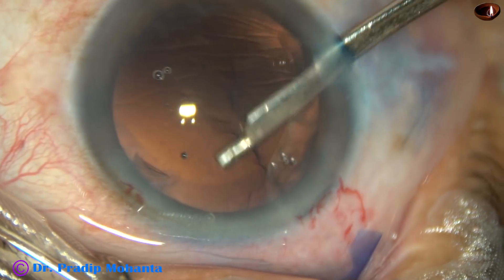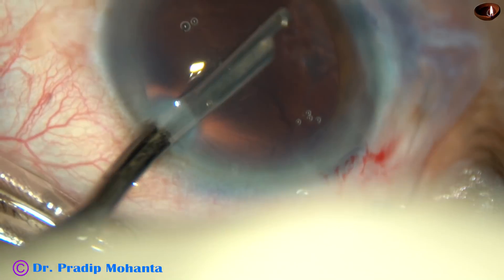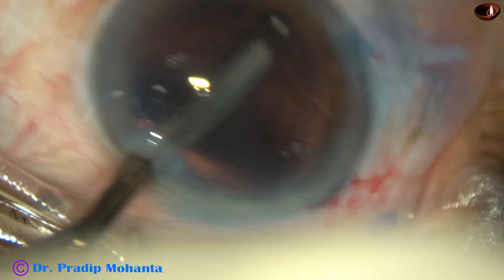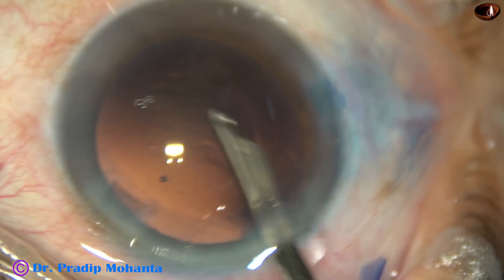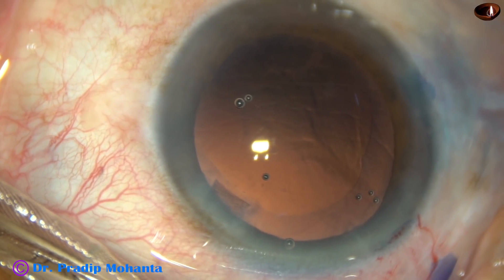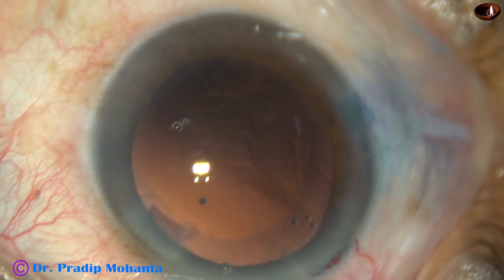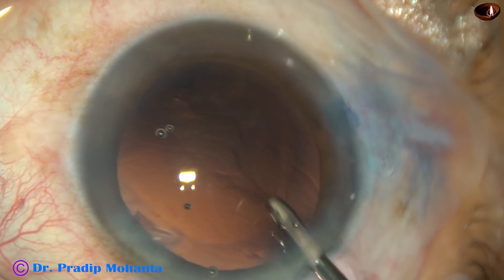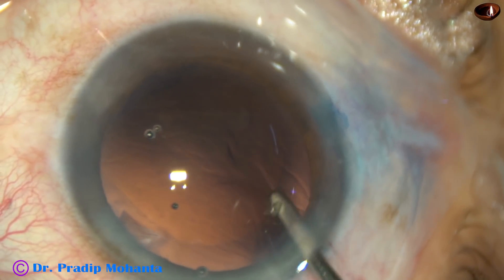We can use bi-manual irrigation aspiration, but I find this instrument very safe. And now, this is a bit of cortex at 6 o'clock. I take the irrigating probe of bi-manual irrigation aspiration and perform hydro-polish. Hydro-polish means using the irrigating fluid to polish the posterior capsule.